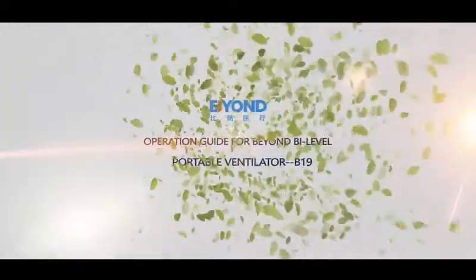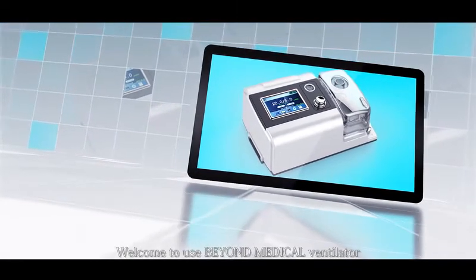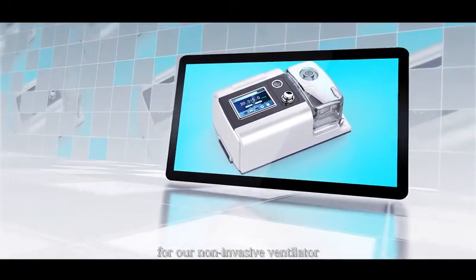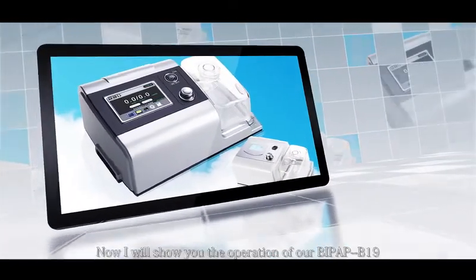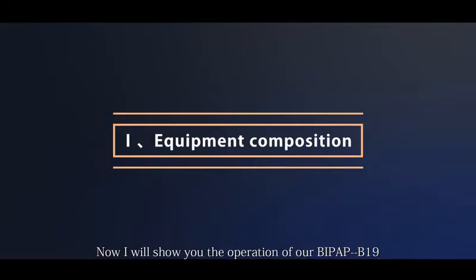Operation Guide for BEYOND Bi-Level Portable Ventilator B19. Welcome to use BEYOND Medical Ventilator. For our non-invasive ventilator, we have CPAP, AutoCPAP, and BiPAP. Now I will show you the operation of our BiPAP B19.